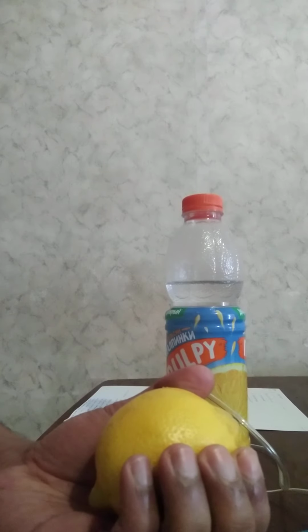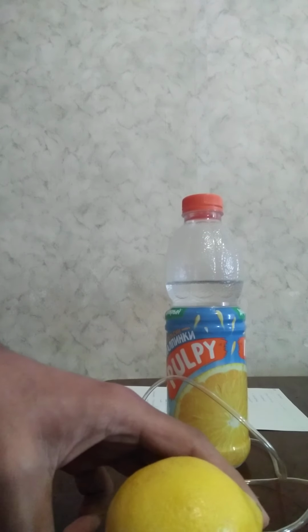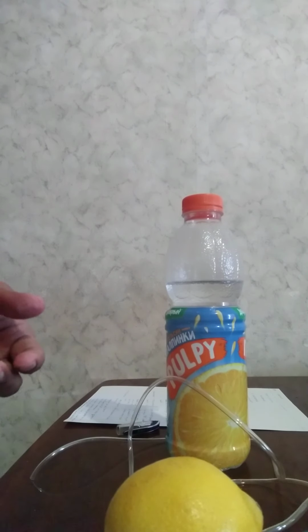We will not apply cotton at this point. Such injections are done for long-term release of substances. For example, rabies immunoglobulin, or for example, in Mantoux test to see allergy of the patient.